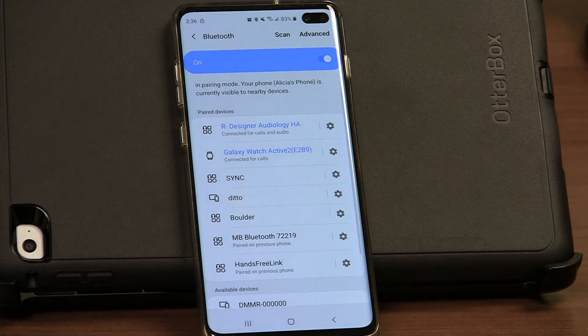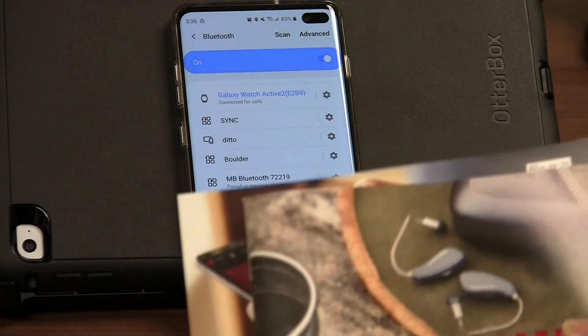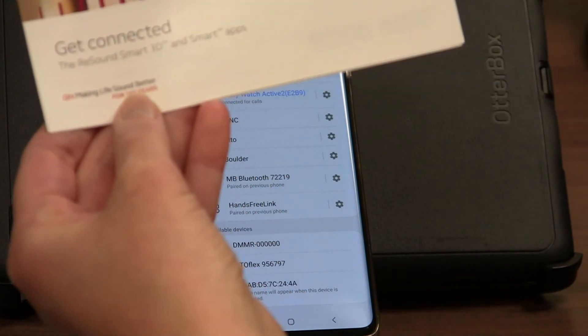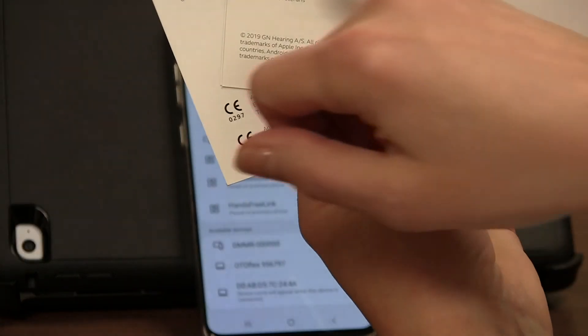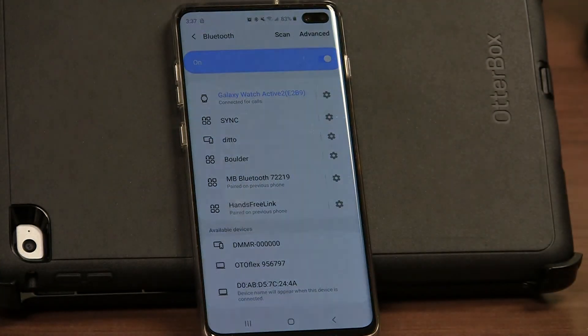At this point you can go back into your Play Store or app store and download the manufacturer's app to connect to the devices, should you wish to do more things, and start playing with your hearing aids. Finally, all devices have an instruction manual that you received with your fitting. If you have any questions, find the section that talks about smart apps and the phone, or go to your instruction manual. You can always find a phone number and a website for more information, or call your audiologist and I'm sure she'll be happy to help.